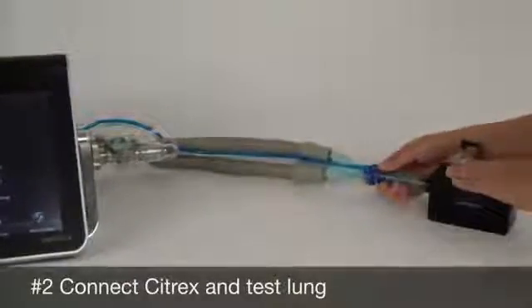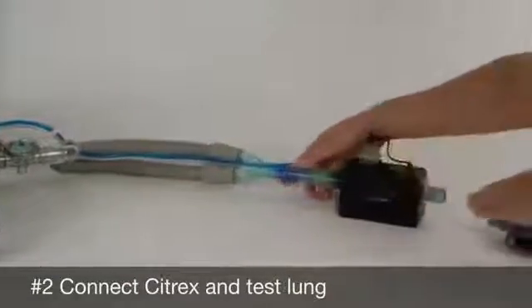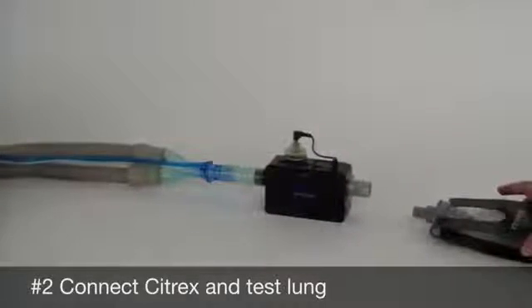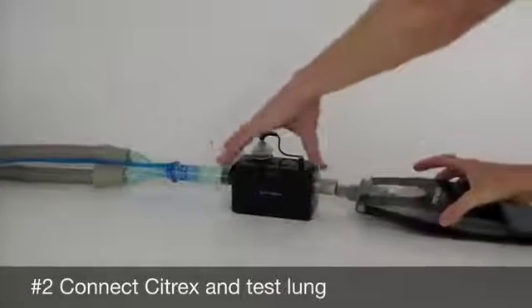First, connect the patient circuit to the medical ventilator at one end and the Citra-X device with the test lung at the other end.